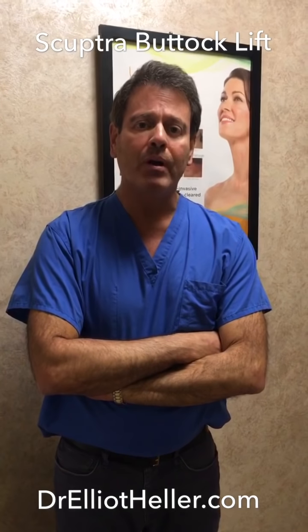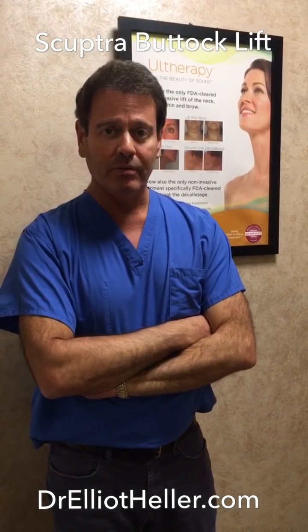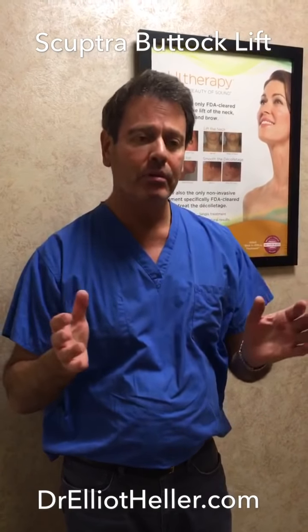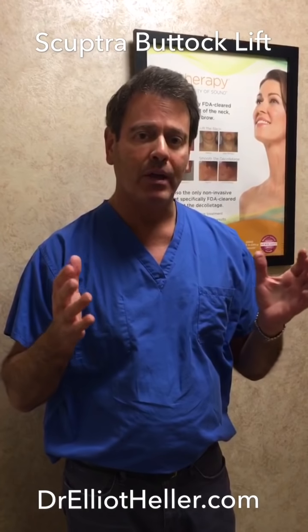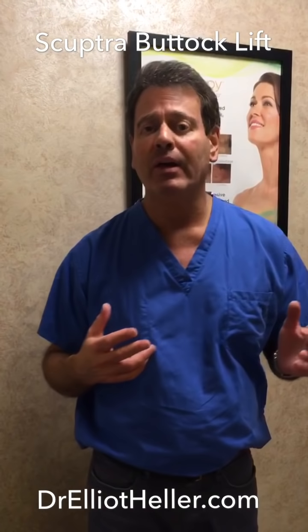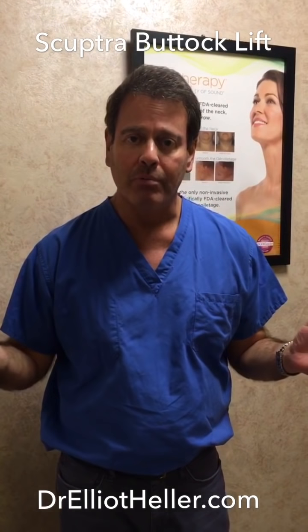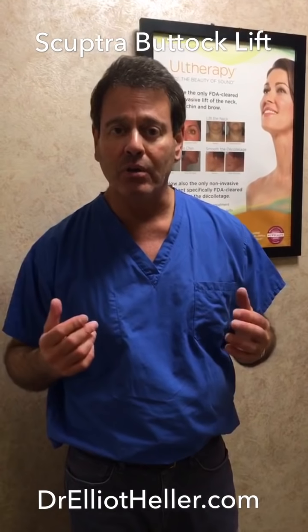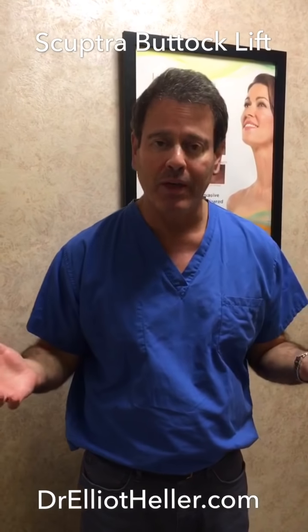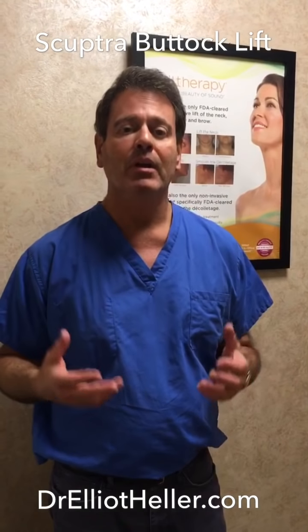We're going to be doing a Sculptra buttock augmentation today, which means using a filler to place in the butt skin and superficial fat area to make it rounder, broader, and higher. Sculptra is used in lieu of fat. If the patient does not want to have the fat procedure done or has not enough fat, then we're using Sculptra to make the butt much nicer. It's a 10-minute procedure, practically painless, and it works.